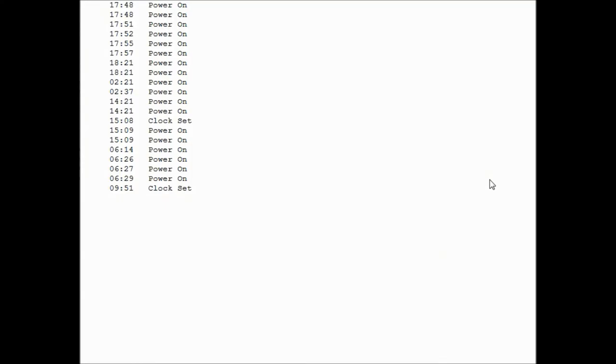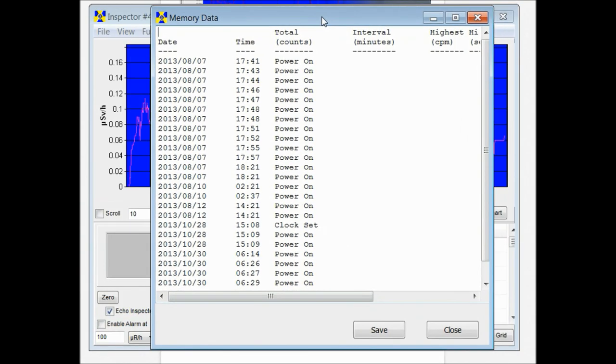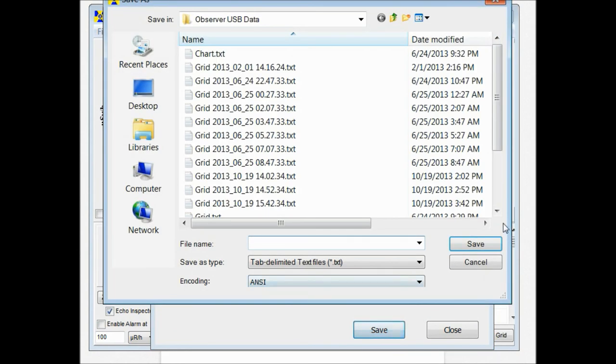Once the data is downloaded it'll pop up and show you your collected readings. And then you can save it wherever you like.